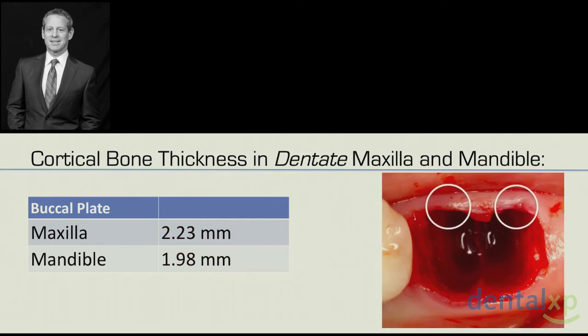Now, what was interesting to me is that all these articles, and there were some others that measured cadaver studies and radiographic studies, they all separate their measurements into mesial and distal at the side of a molar. So they're measuring here at the root surface. That's not where we're engaging the plate. And it's already thick there. They're telling me that this is already a thick buccal plate, don't worry. That's not where I'm engaging a type C socket, is it?